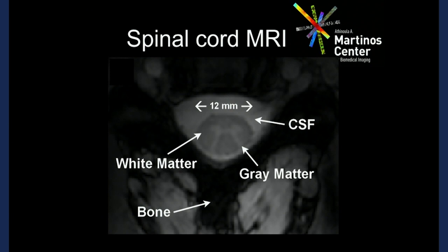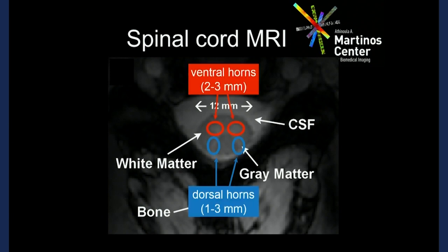And especially so when you look at these things, like the butterfly of the gray matter. So to use the previous terminology from Dr. Greenberg, these are like the part that has the type 2 wires. So this is like looking at your pinky finger, and I want to look at the pinky nail, and then take a look at the half of your pinky nail. I mean, these are really, really small structures, and this is on the cutting edge of what you can do with an MRI.